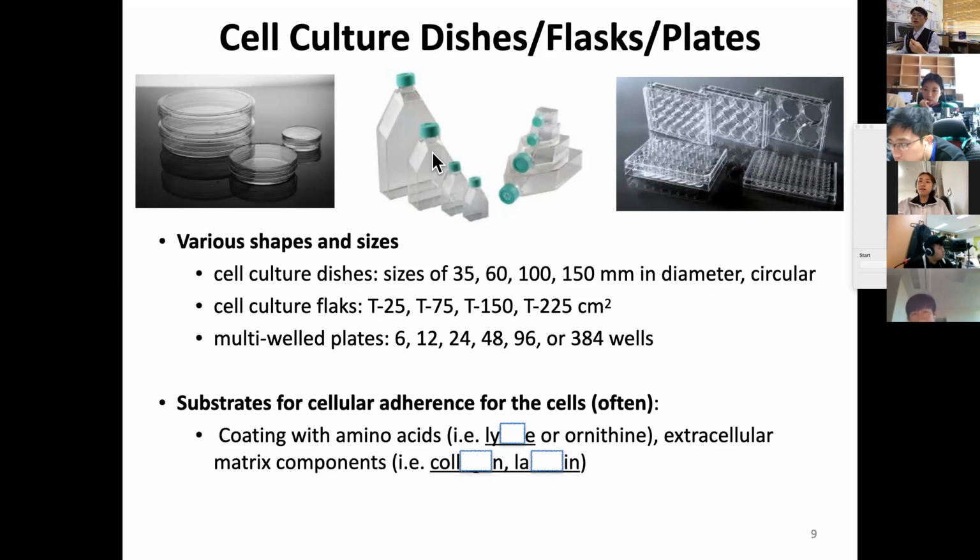However, the great advantage of in vitro experiments is that you can have a multi-well plate, which means you can do experiments simultaneously in 6, 24, even 96, or even 384 wells. So multi-well plates are a great way to do in vitro experiments.